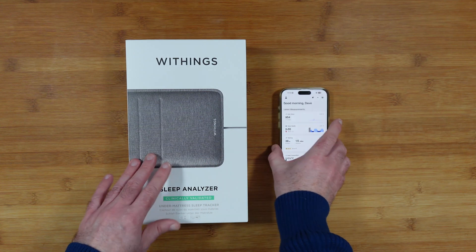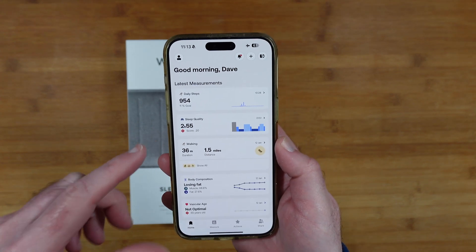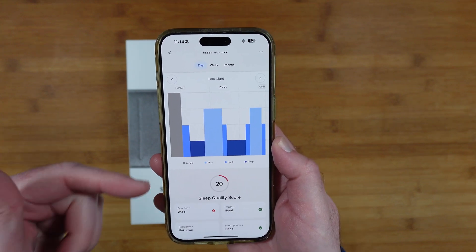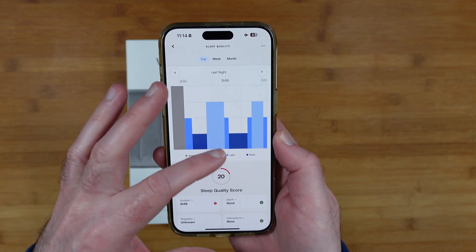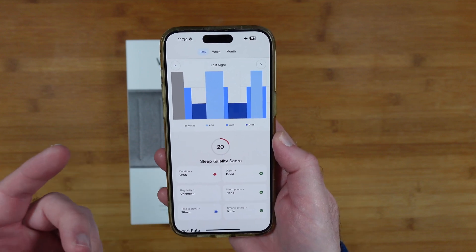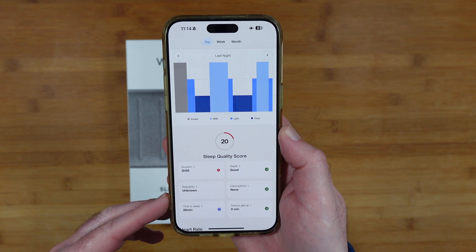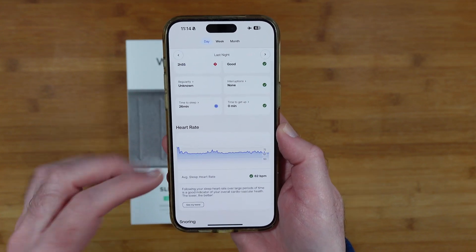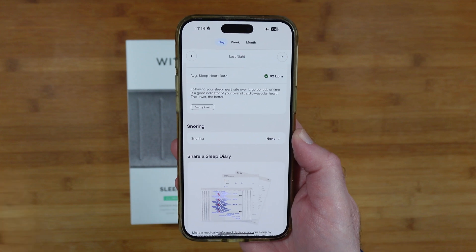The data is displayed in the app under 'Sleep Quality.' I don't sleep very well lately, so this was really interesting — it scores me extremely low. Tapping into the data is very useful: it shows when I'm awake, how long it took me to get to sleep, and when I'm in deep sleep, light sleep, and REM. It says depth of sleep is good, interruptions none, time to get up zero — I wake up and get up straight away. Time to sleep: 26 minutes. Duration is where I have a problem: two hours 55 minutes, which is not good at all. It also tracks average sleep heart rate and shows no snoring.